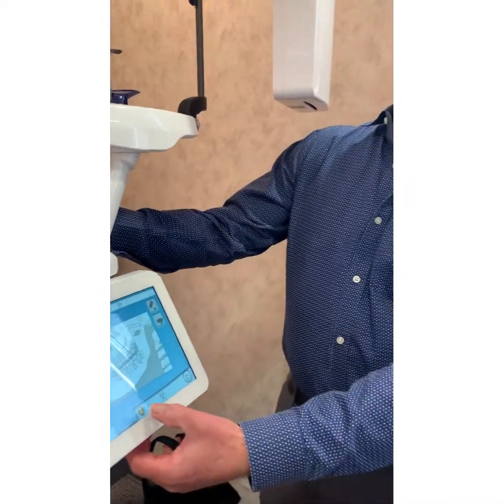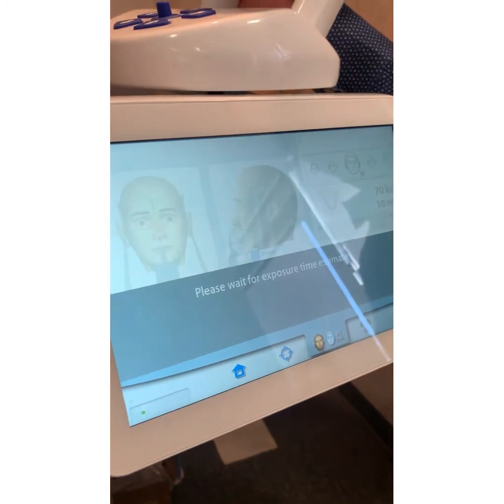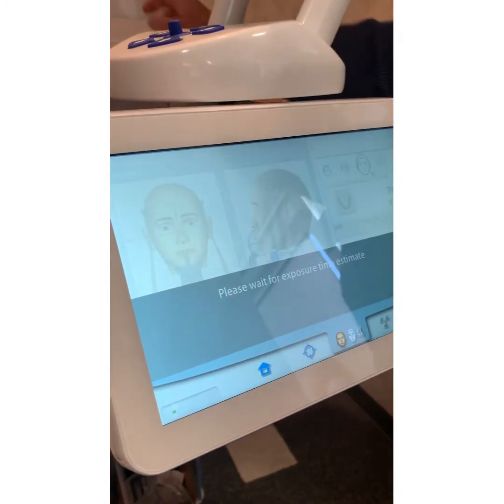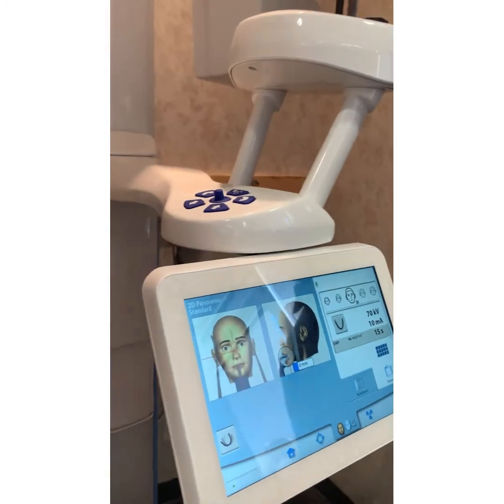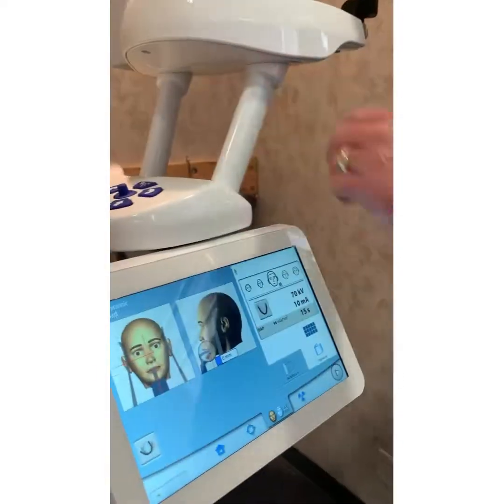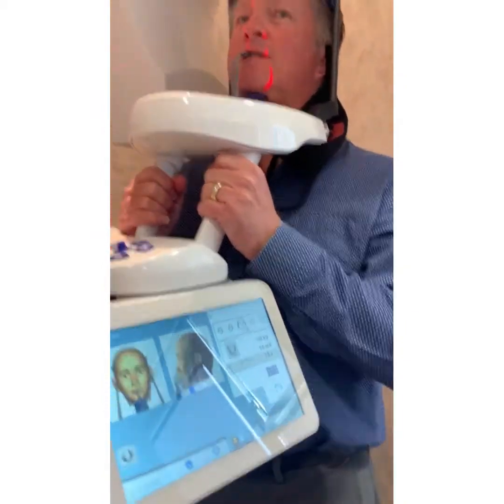Before you put the patient in, you're going to hit the 2 heads button. Is there something that needs to be lined up with their ear, like the center of their ear? That's this line right here. But that's only after you see from 90 degrees that the patient has a flat profile. Then you can validate what your eyes are telling you by lining this line up with this notch in your orbit to the top of the tragus. Once they're here, you line them up, everything is good. I'm just going to take a chance that the guys in Finland didn't lick this.